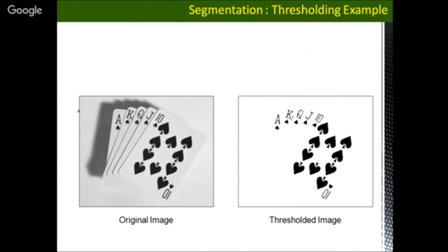Another very important situation, again on point-based processing, is segmentation. This shows that you may be interested in darker areas, as you can see in the simple example of cards, or at times you might be interested in brighter areas also, depending upon how the medical image is acquired or what structure in that medically acquired image you want. Now, if the image is already negated or it is not negated, accordingly the thresholding will mean how many pixels are distinguished or are passed with distinction.